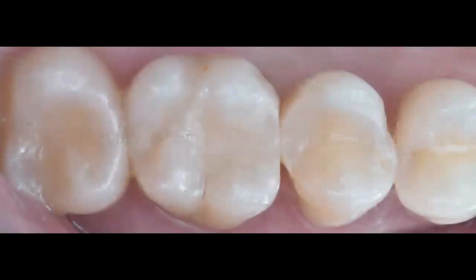In order for us to understand when a personalized matrix is needed, I want to start sharing with you this clinical case, because it is going to be a really good example of when a personalized matrix would be needed. What you are seeing here is tooth number 13 and 14 that were restored some years prior. I want you to observe the over contour distal wall of tooth number 13. At the same time, I want you to observe the flat mesial wall of tooth number 14.